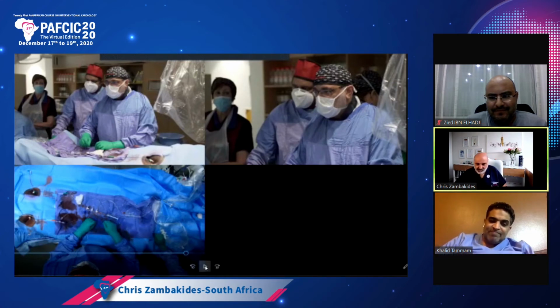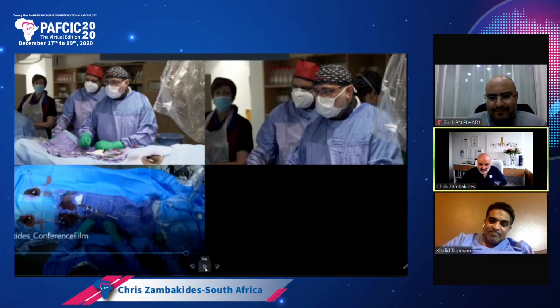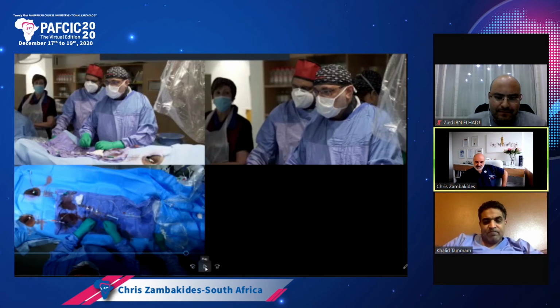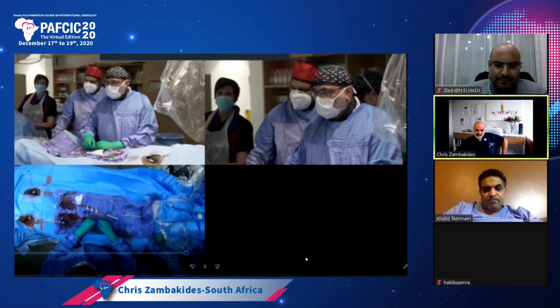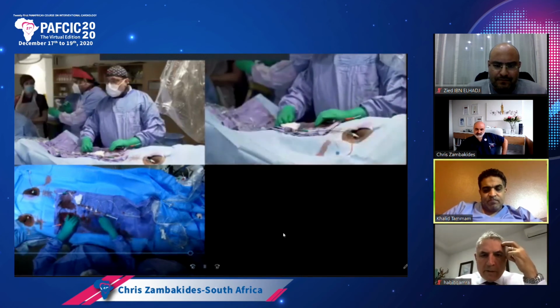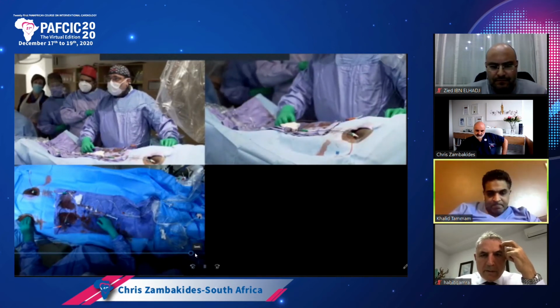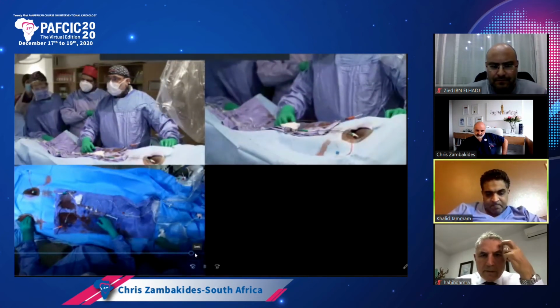It's on a different thing. I'll try and show you just now. Let me first just go through this, and then I'll show you now with a slightly bigger one, hopefully. About the stent on this one. You see, we're sitting on top of the stent there. You've always got to be careful that your catheter does not get sucked in. So you pull that back.